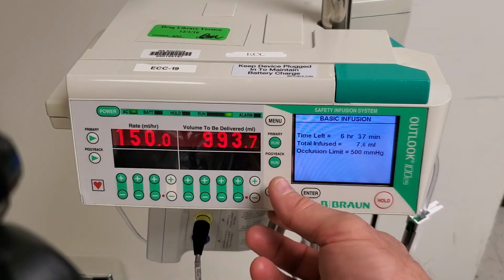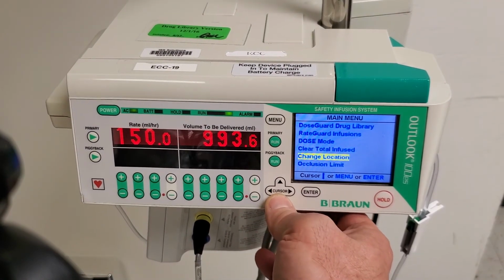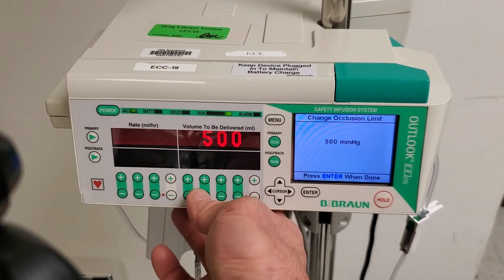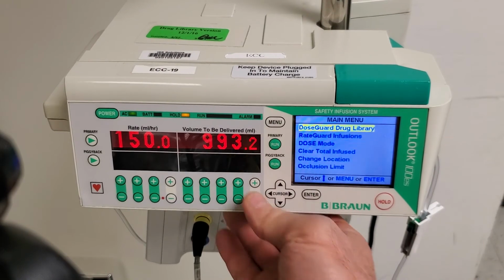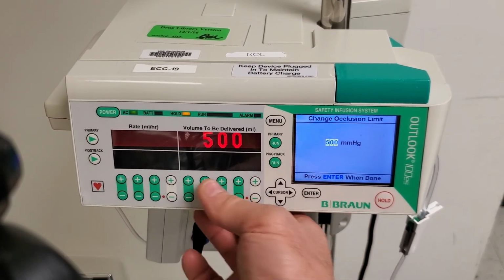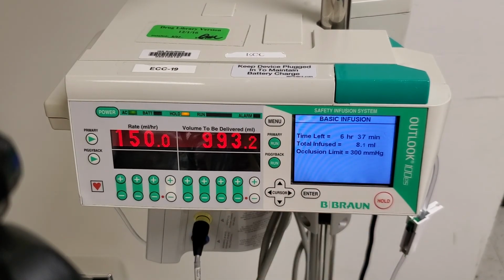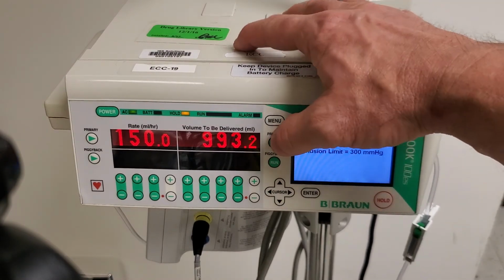Probably best to leave these limits alone unless there was a very specific reason that, and you would know this when you left the hospital, if there was a specific reason that you needed to change this limit. So those are the alarms. Those are the basic modes.